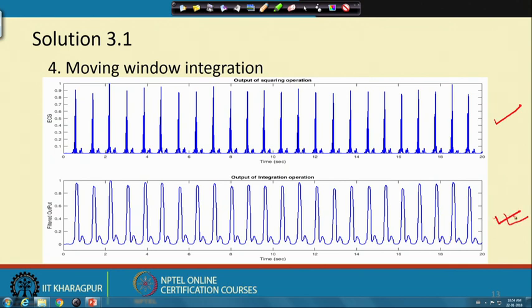Okay. So, the ragged peaks here become a post like structure, but one good thing happens: it becomes a single post. So, for each QRS complex we have one post. So, that is the advantage we get here following this step of moving filtering.